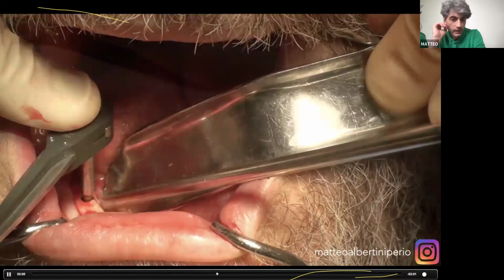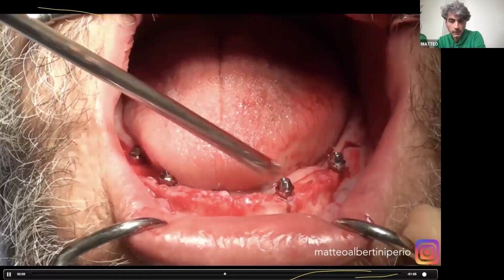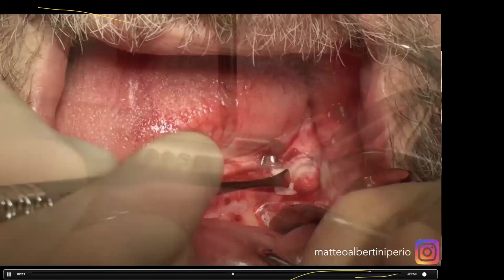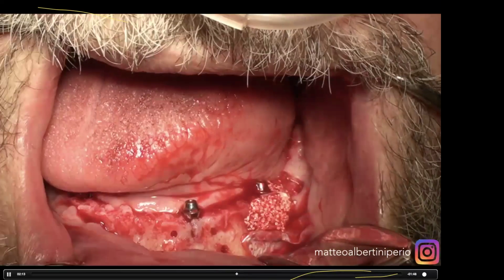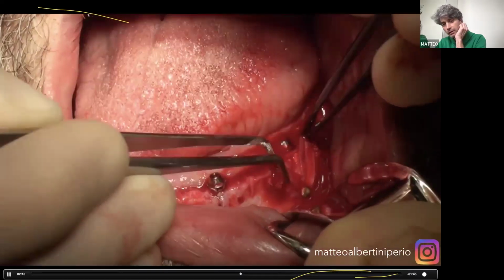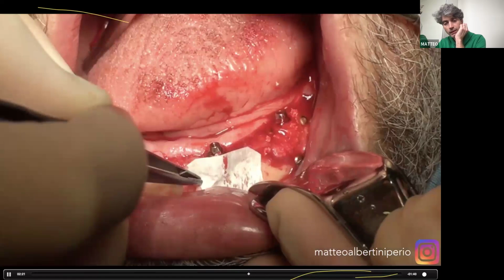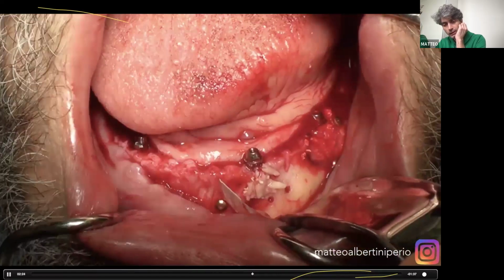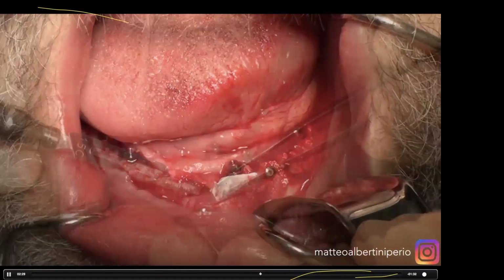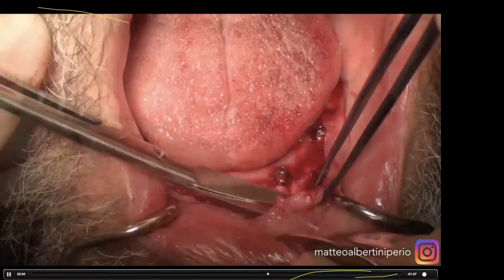We placed the implants and the prosthetic abutments. These are permanent abutments. We place the implants without the template, as I said, and install those permanent abutments. And we're performing a small horizontal guided bone regeneration procedure to increase the thickness of the buccal bone.